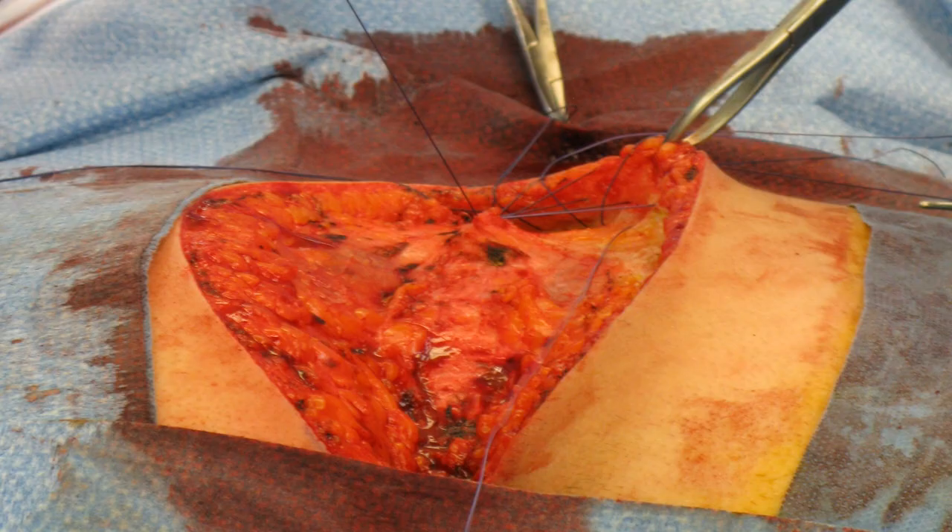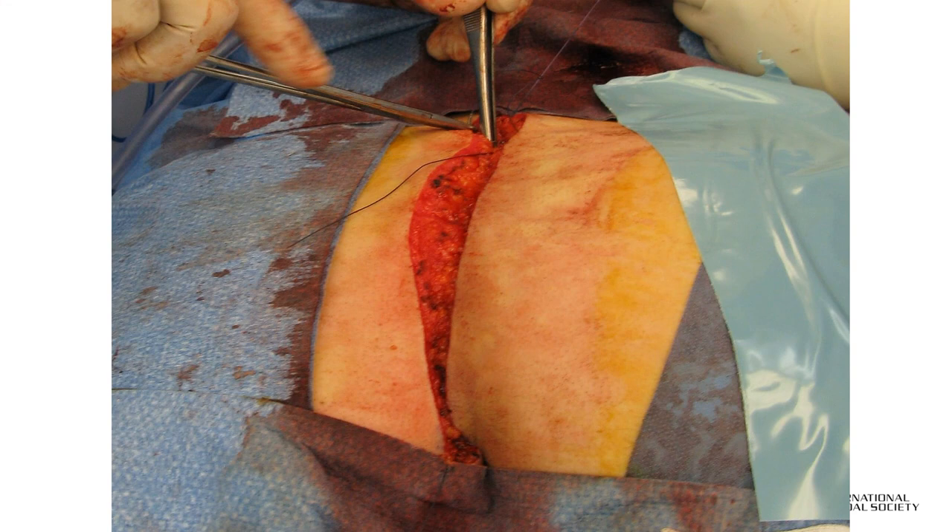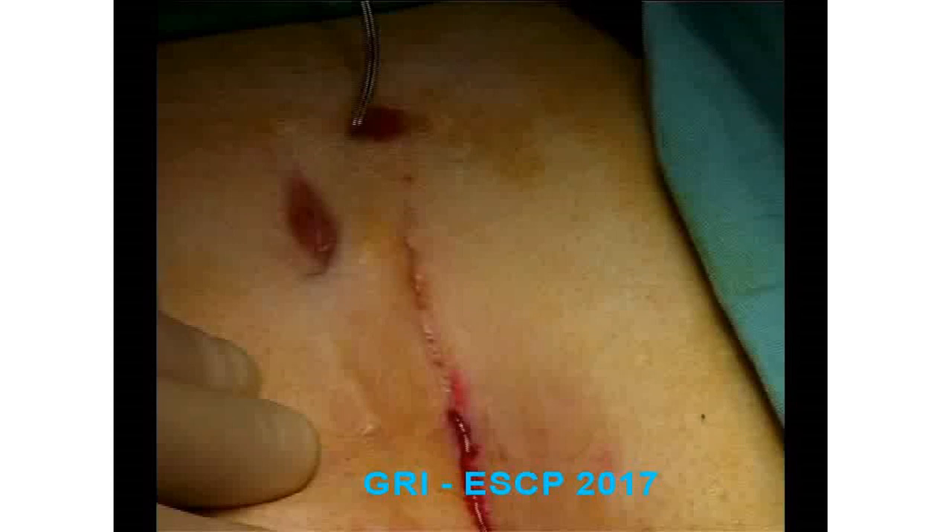There is the excision: this side is vertical, this side is at 45 degrees. The flap is raised and secured in two layers. The first layer is from the apex of the flap to the new midline. The second layer is the free edge of the flap, then a subcuticular closure with a dressing.